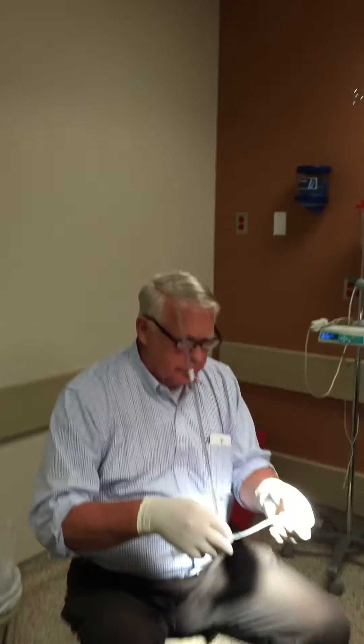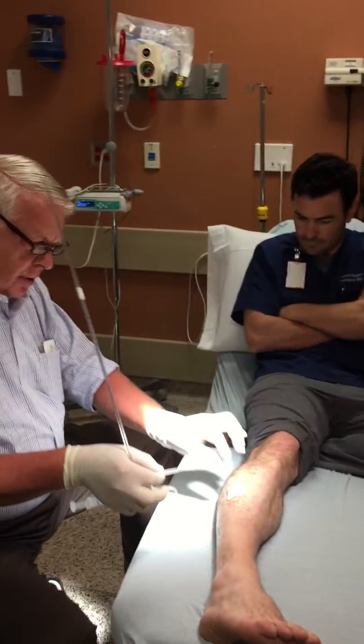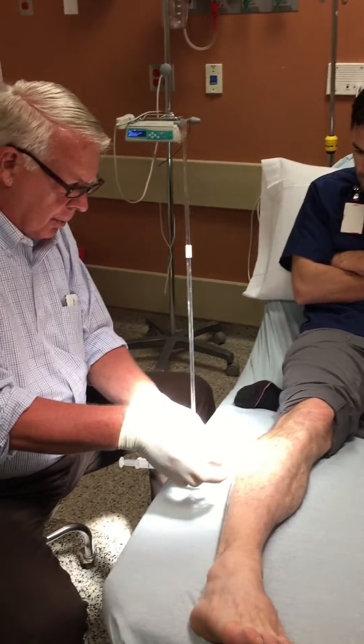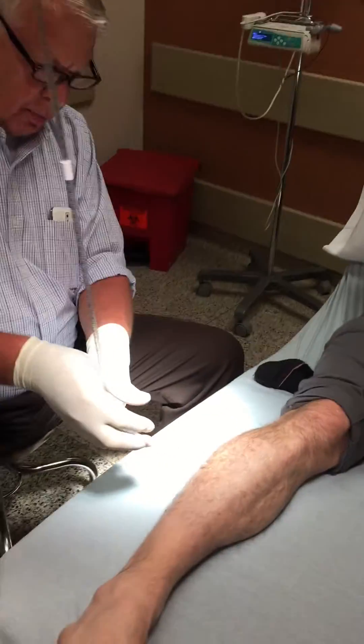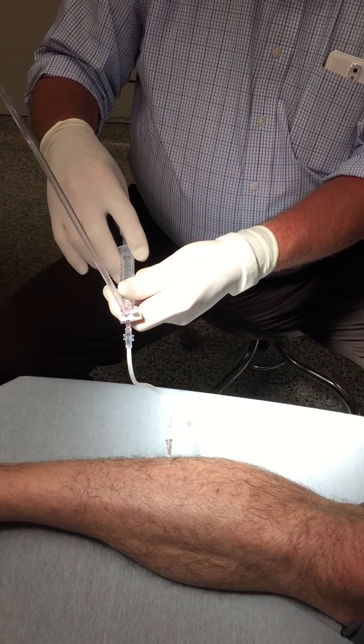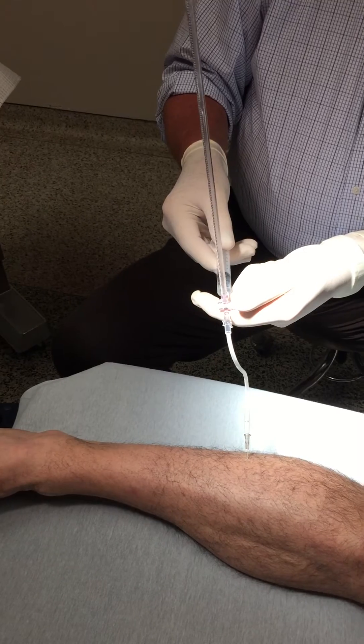Here, you can run this needle directly on to the area there, but we'll just go right in the compartment, just right there — we're in the compartment. Sure, we've got good flow. We've got good flow. Okay.